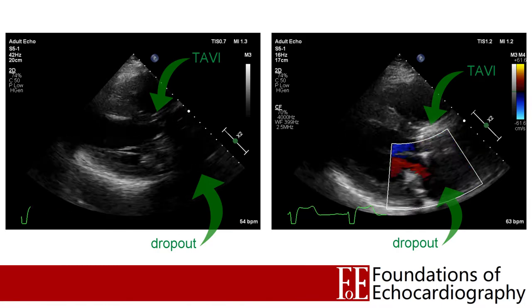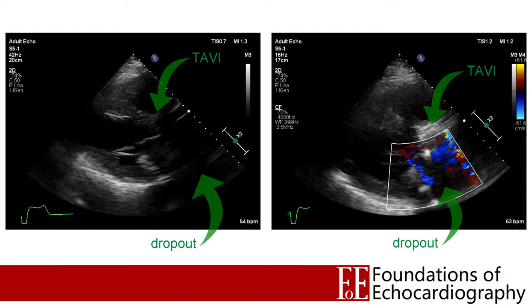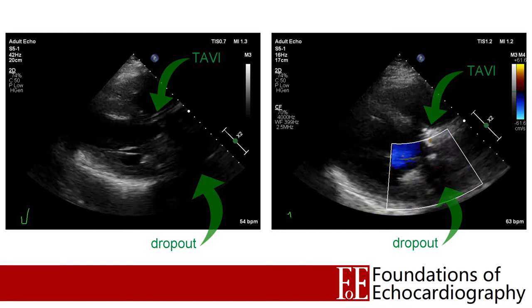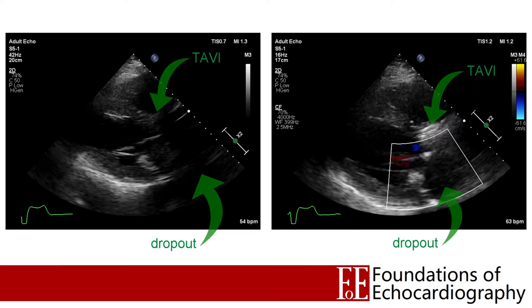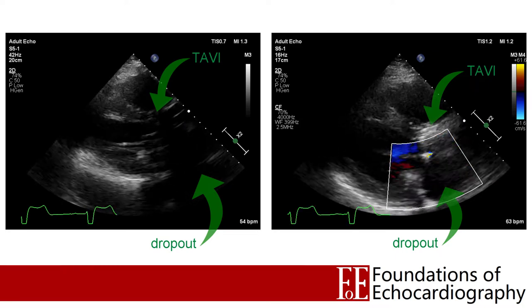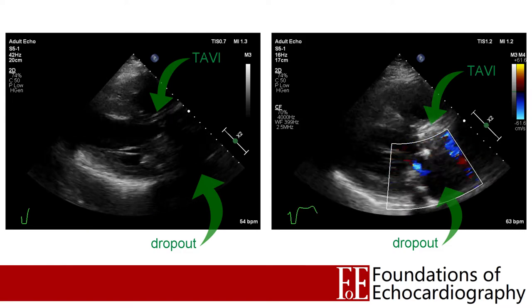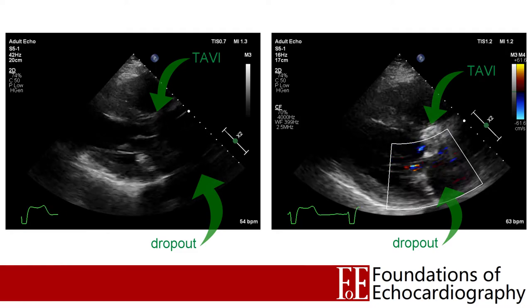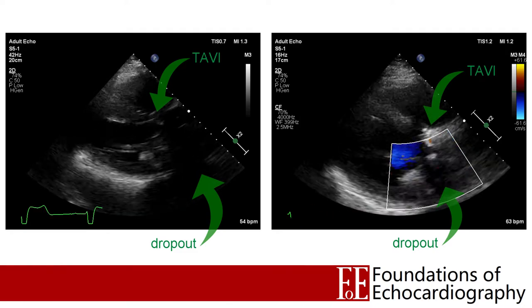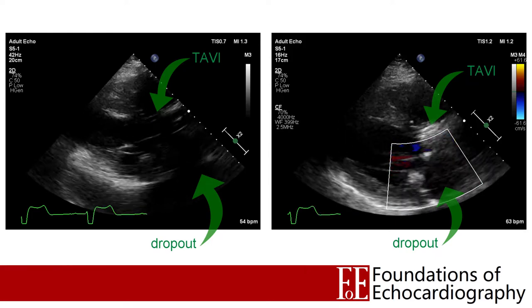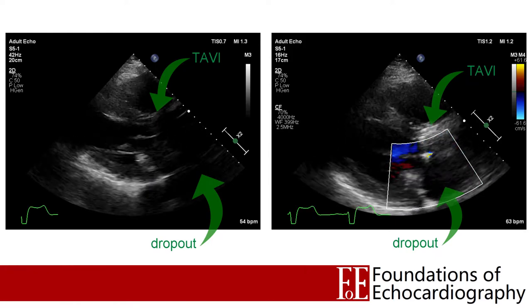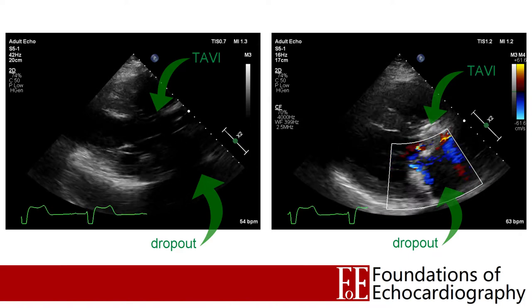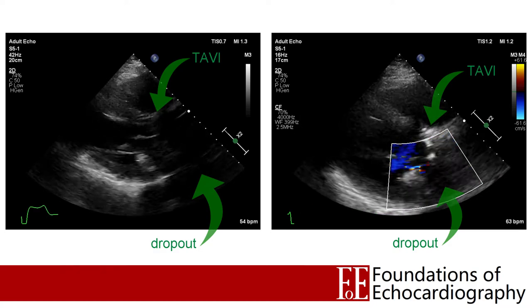The two images we're looking at now are both parasternal long axis views, with the 2D image on the left and a colour flow box placed over the left atrium on the right to capture any mitral regurgitation. I've chosen this image because the quality overall is pretty poor — this is a patient who's just had a TAVI and has unfortunately deteriorated and ended up on a mechanical ventilator. They've got positive pressure ventilation, they're lying supine, and they now have prosthetic material in the aortic valve position that's casting a shadow over part of the left atrium, giving us diminished returning signal for both the 2D image and the blood flow in the left atrium.